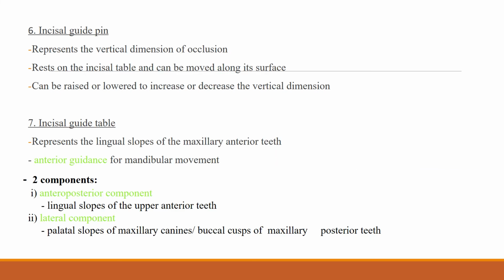Okay, coming to the incisal guide pin, it represents the vertical dimension of occlusion and rests on the incisal table. It can be moved along its surface, raised or lowered to increase or decrease the vertical dimension. That is the long silver pin.